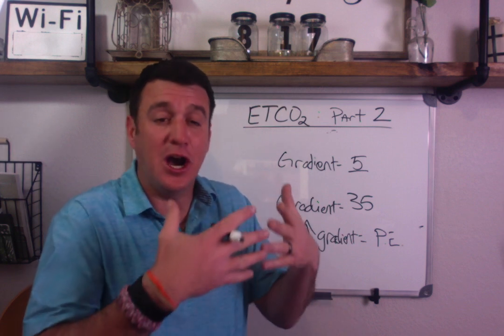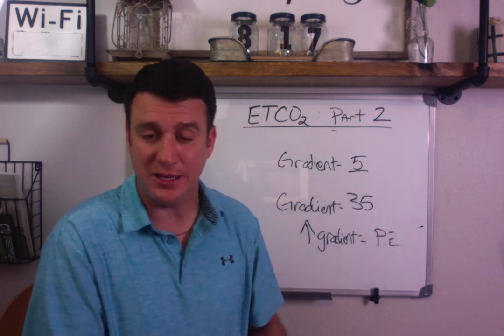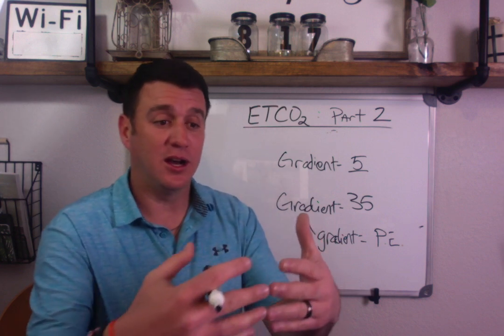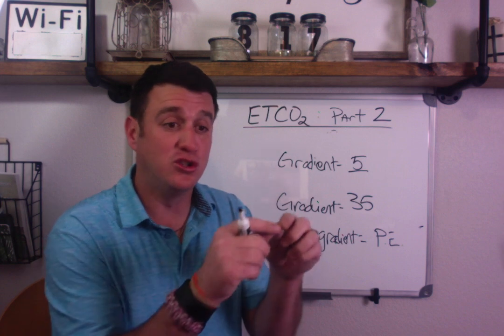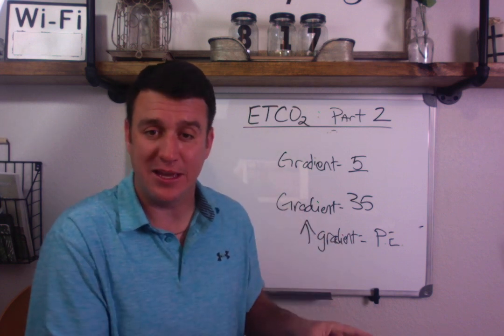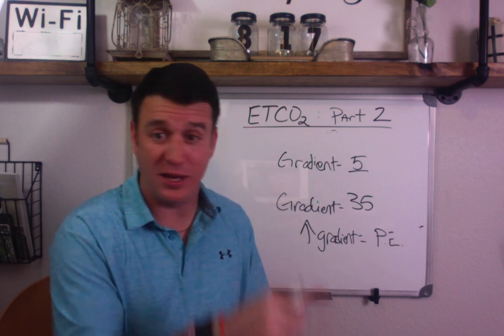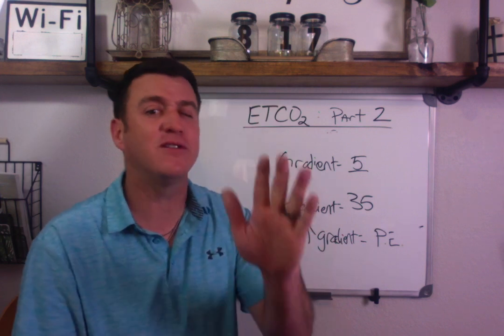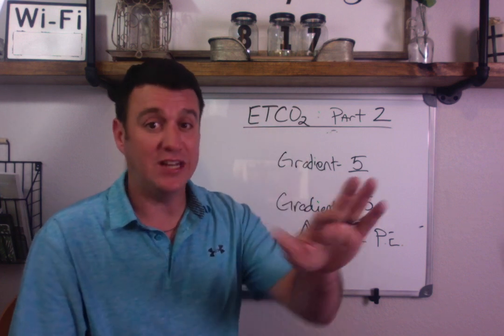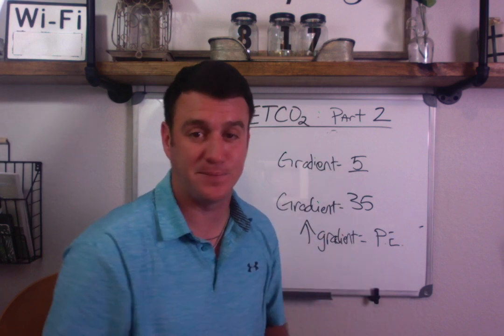You see, an end-tidal CO2 less than 15 during a cardiac arrest situation can be used as an indicator of provider fatigue. They were doing really good chest compressions at first. They were circulating blood, and we were getting back an end-tidal CO2 greater than 15. When it drops below 15, you need to say, hey, you're getting tired, let me jump in.